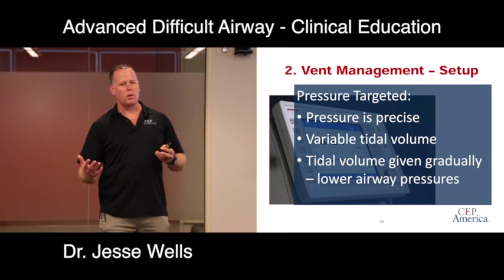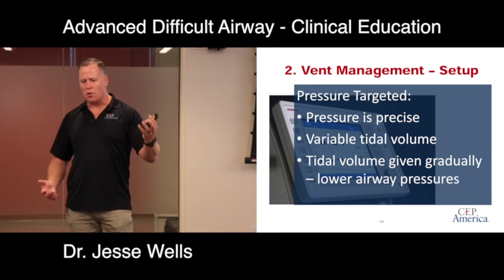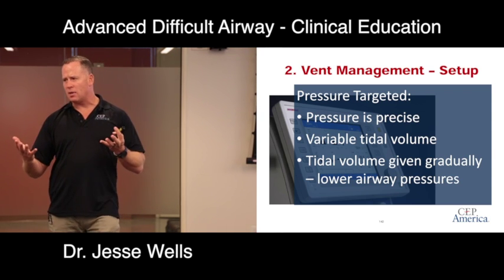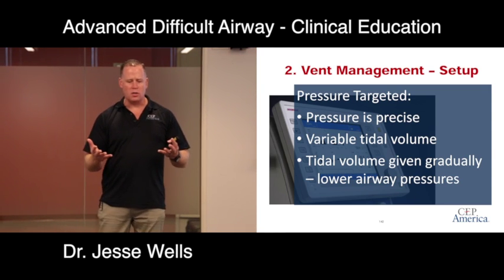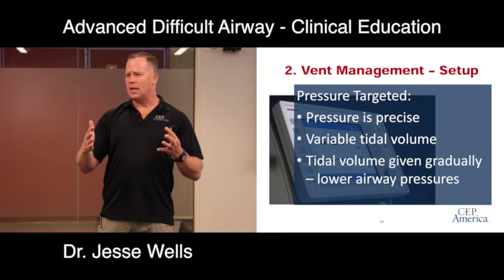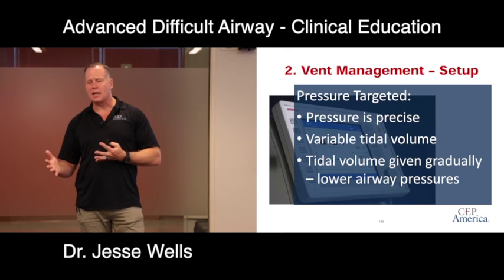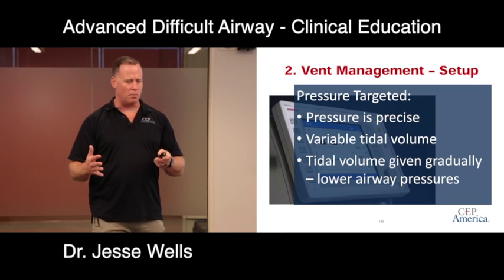Now, the best of both worlds is, what if the ventilator could consider both the pressure and the volume, and on a breath-to-breath basis, every breath, adjust itself to maximize both. And that exists now, basically this combined setting where you set a target tidal volume and you set a threshold for pressure, and the ventilator actually adjusts on a breath-to-breath basis depending on the resistance to meet your volume goals but not exceed your pressure goals. And this is basically the best of both worlds.